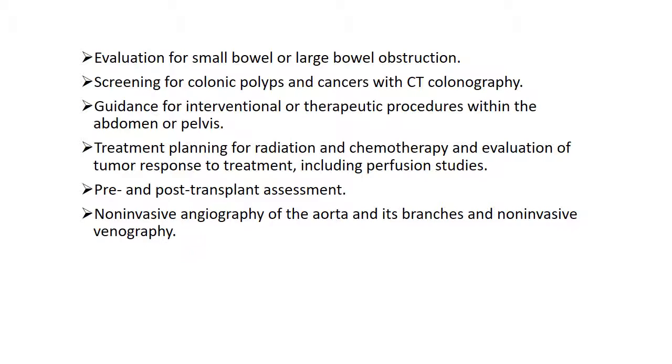Pre and post-transplant assessment, so you're looking at the structures before transplant to see exactly what the anatomy looks like before you go in and do the transplant. Also looking at the transplanted organs later on to make sure that they are continuing to function well and thrive well, such as seeing if a kidney is continuing to stay normal size or if there is shrinkage of that kidney occurring.